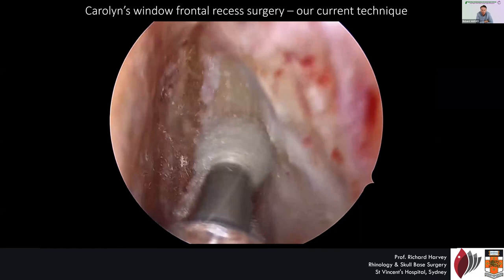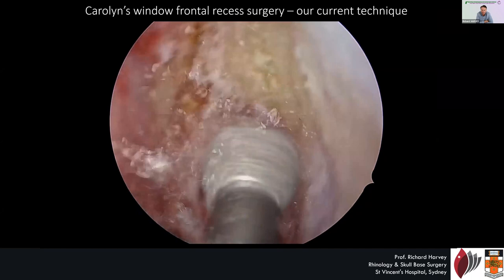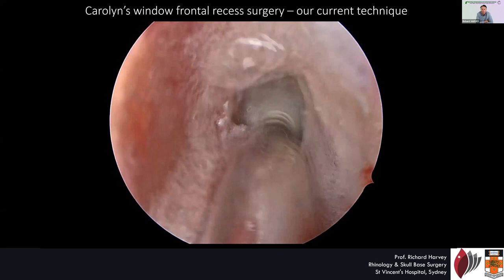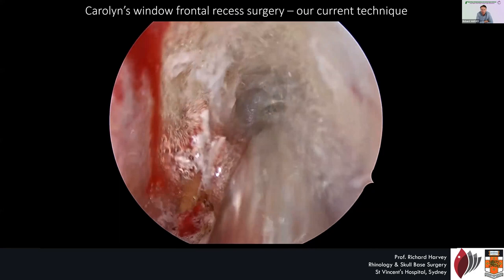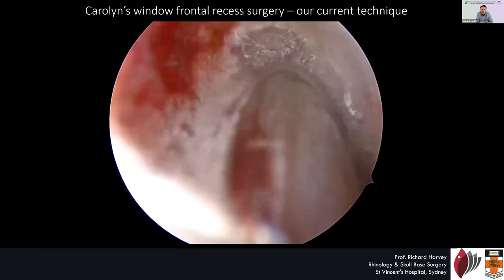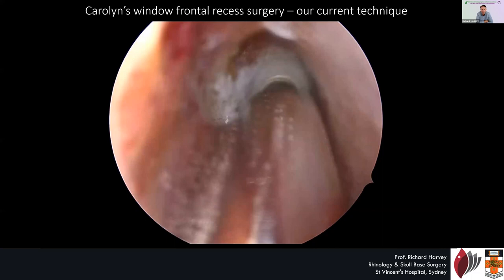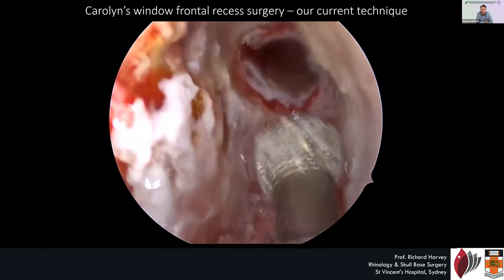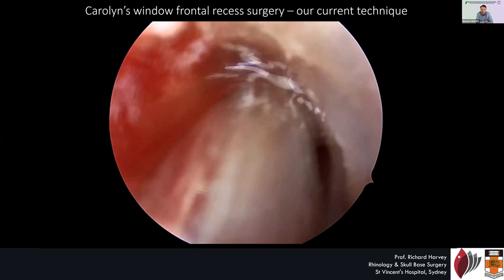Surprisingly to some, patients are not more uncomfortable than if you nibble the bone with Kerrisons and other things — simply removing the bone here doesn't create more pain. In fact, taking more bone and minimizing the amount of exposed bone at the end of the operation actually gives patients a better result in terms of comfort level. So we now use this 30,000 RPM four-millimeter burr. The straight burr has about a 15-degree bend on it, but the whole thing is essentially a straight instrument, with a zero-degree scope.